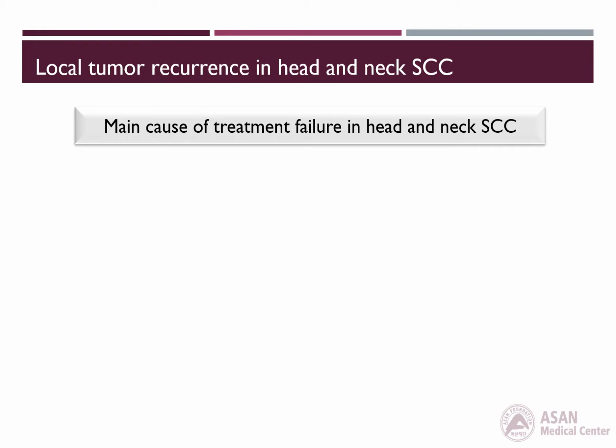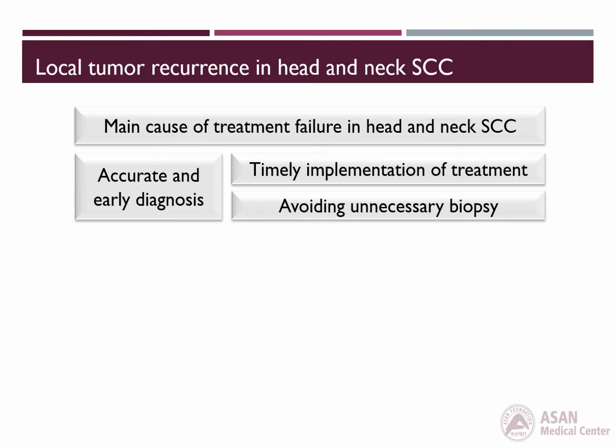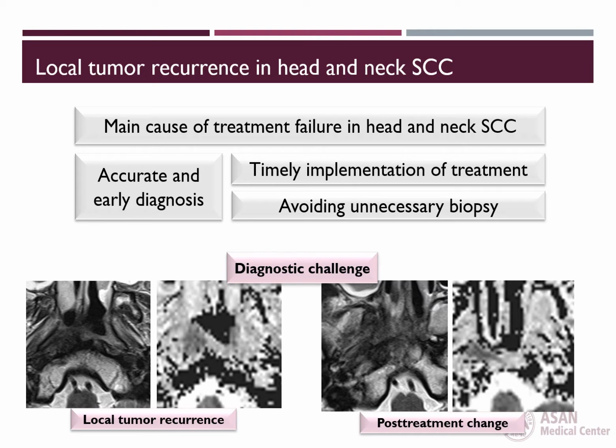Local tumor recurrence in head and neck squamous cell carcinoma is the main cause of treatment failure, reported more frequently than distant metastasis, and an accurate and early diagnosis is important for timely implementation of treatment and for avoiding unnecessary biopsy in the heavily radiated tissue. However, differentiation between local tumor recurrence and post-treatment change frequently remains a diagnostic challenge in clinical practice.